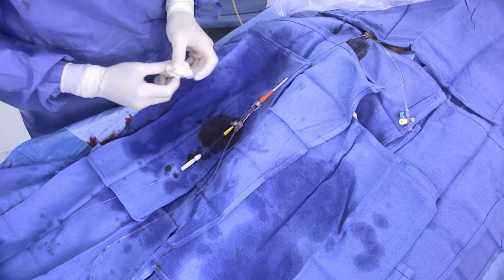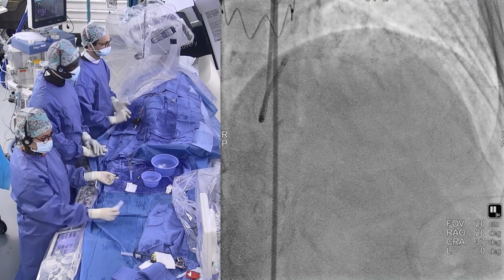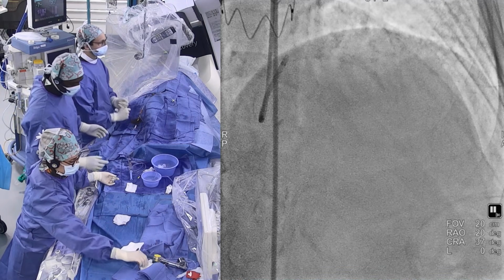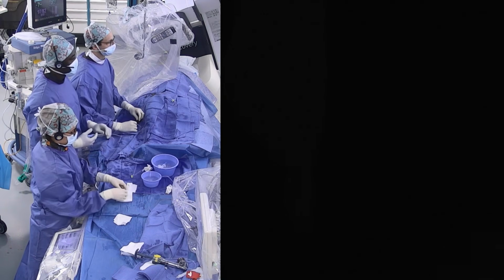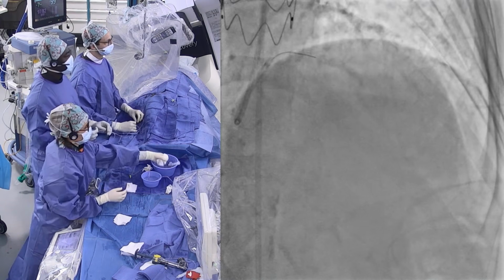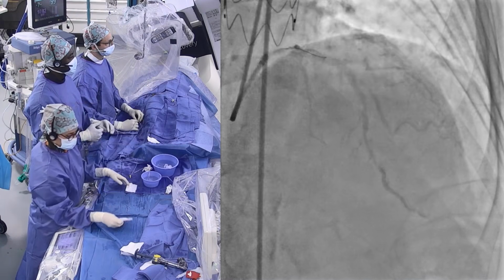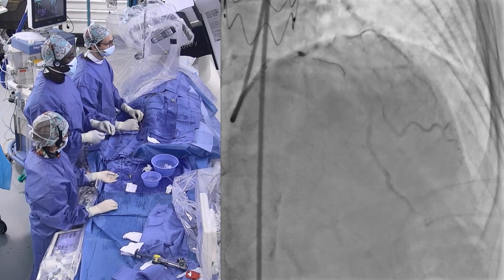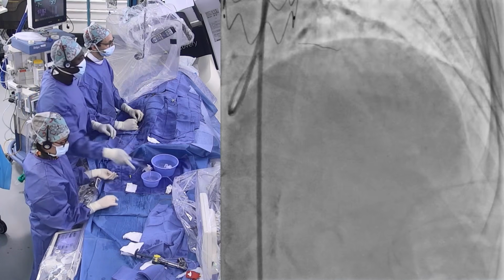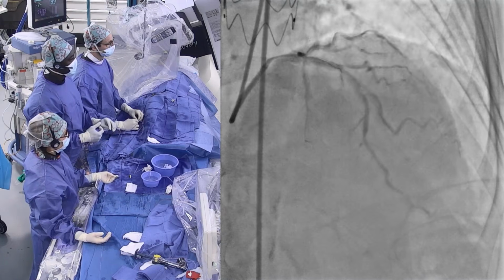Okay, guys, so if you want, we're going to now start the case. And Benjamin is going to wire the LAD with this new RotaWire Drive, a more trackable, more deliverable wire. So meanwhile, if you have any comment, please feel free. Because the other option, Emanuele and Flavio, could be to use a regular wire and to go for a microcatheter exchange. Is it something that you do routinely?